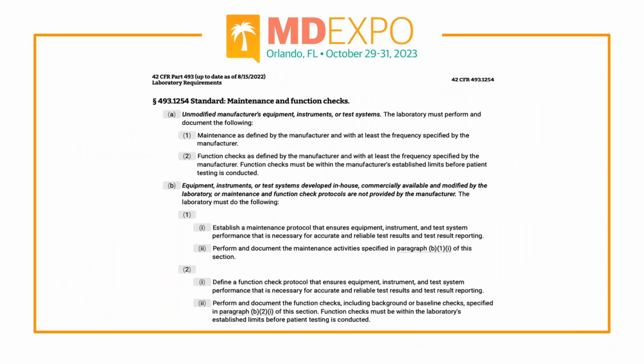So let's talk about this one here. Under Title 42 Code of Federal Regulation, this basically lists the standards or requirements for testing of laboratory equipment. The key thing to remember here is that you can't use your own method of determining the PM frequency, risk criteria, or whatever. It says the maintenance is defined by the manufacturer, and at least with the frequency established by the manufacturer. Very clear cut here, and it gives you all the details behind it.